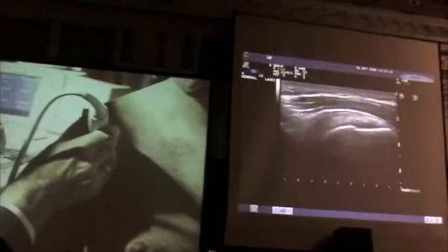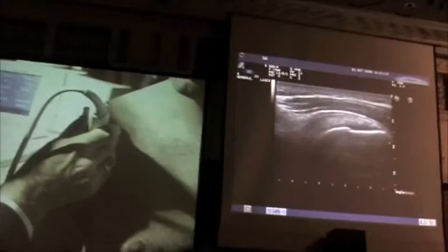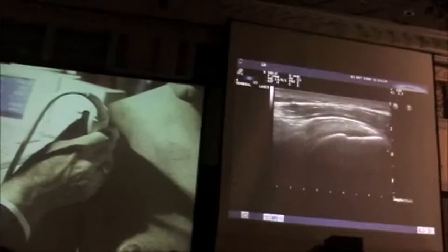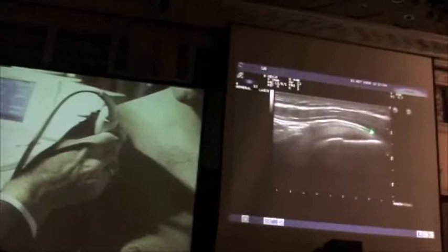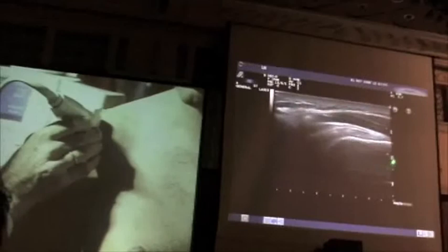In terms of judging the tissues, we should have a good high-frequency transducer. You should see the interface between the tendon and the bursa very nicely. The tendon surface and then the bursa is a thin hypoechoic stripe. That bursa normally is never thicker than the cartilage over the humeral head. The cartilage over the humeral head is thicker than the bursal tissue over the supraspinatus tendon — that's a good internal landmark. Keep your transducer perpendicular and then slide, making that two-centimeter movement around the acromion while keeping the transducer perpendicular to the surface. That is very critical.